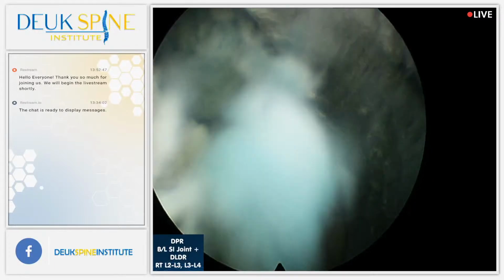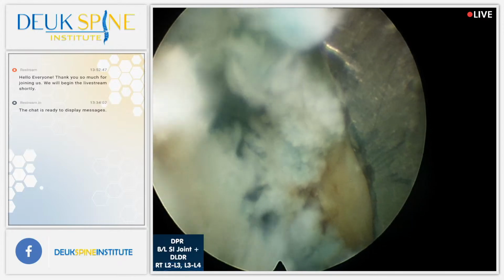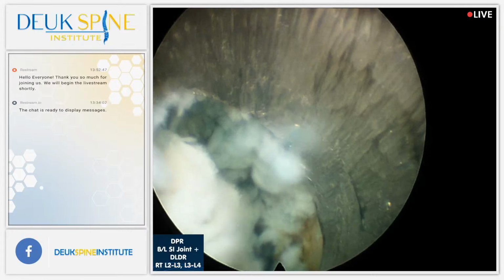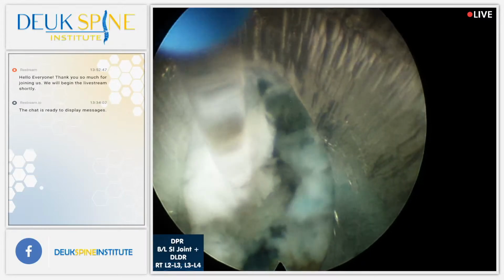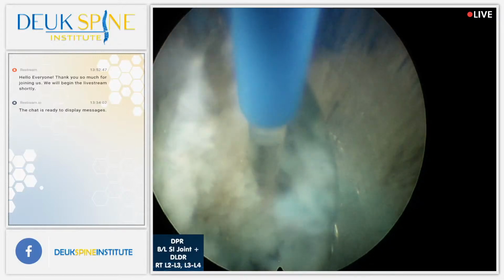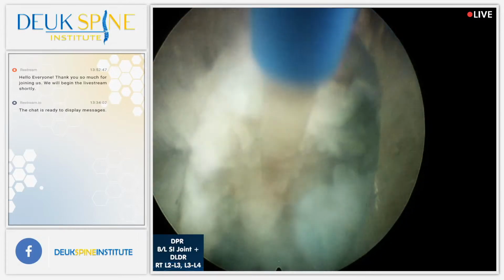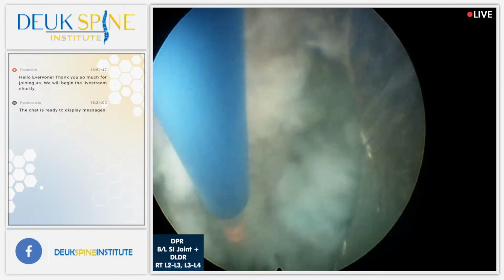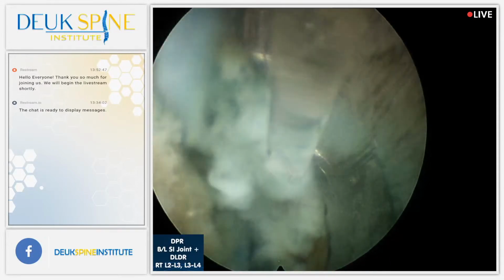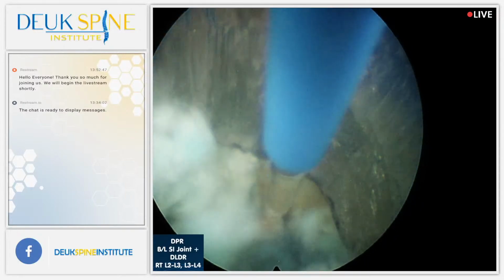So I've prescribed to this technique for years. I think it's the best technique, the safest technique, the most effective. But it does require hammering that metal spike into the patient's disc, which you guys all see and don't like. But trust me, it's safer that way and more effective. If you don't do the inside out technique, you really can't do the Duke laser disc repair.